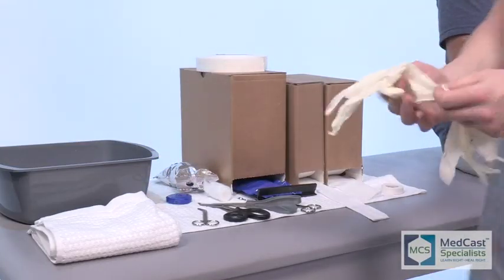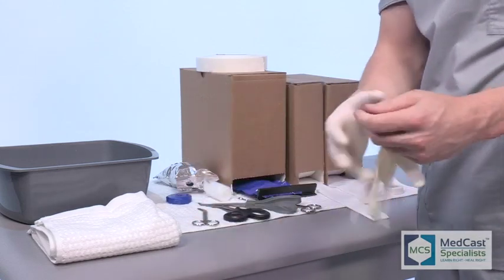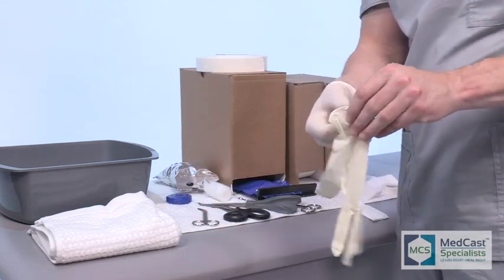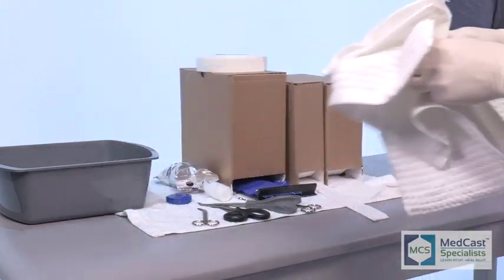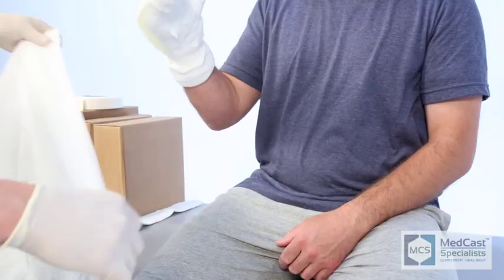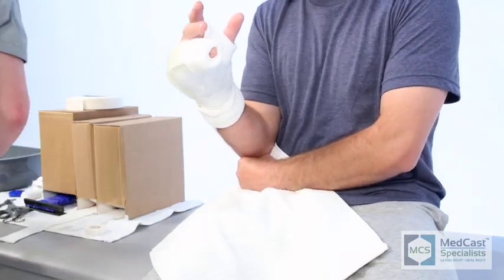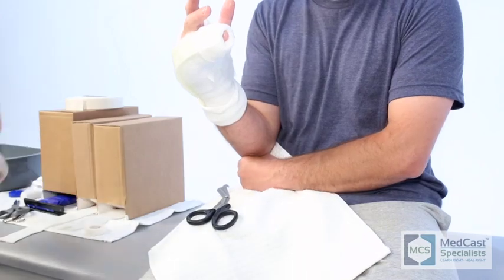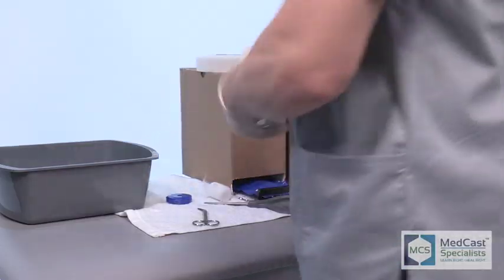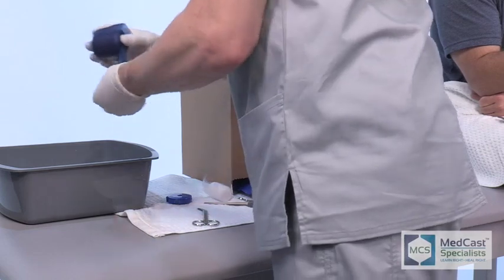Use the fiberglass to determine the length of your cast. Fold the stockinette back so it hits the fiberglass — make sure your fiberglass will be the length of the cast you want, then fold those edges back. We like to double up the edges to give an extra layer of padding. You can usually get away with one two-inch roll of cast material. If you go up to three-inch, it makes it much harder as you start moving around the digits.